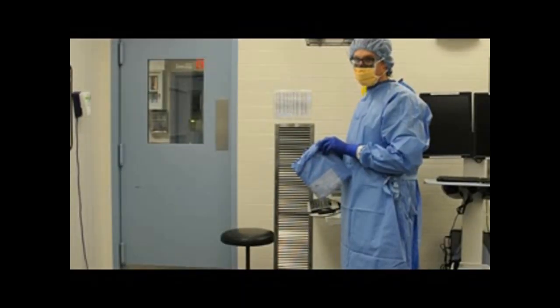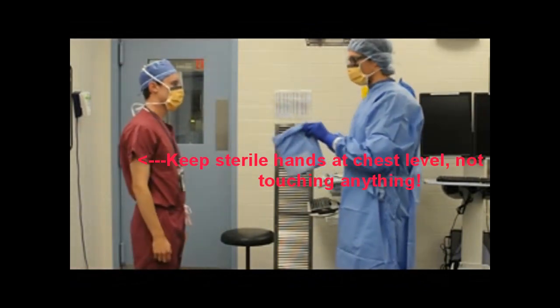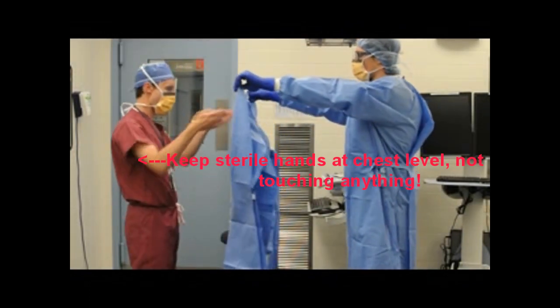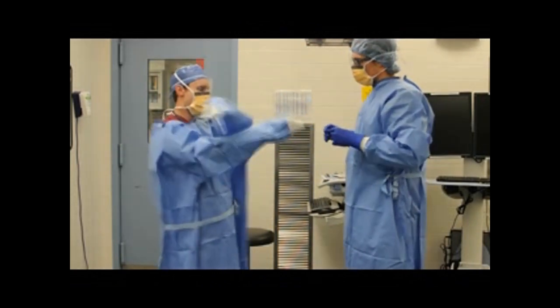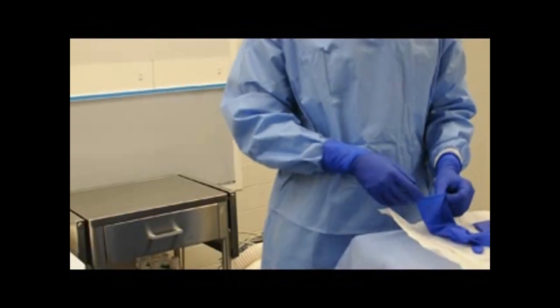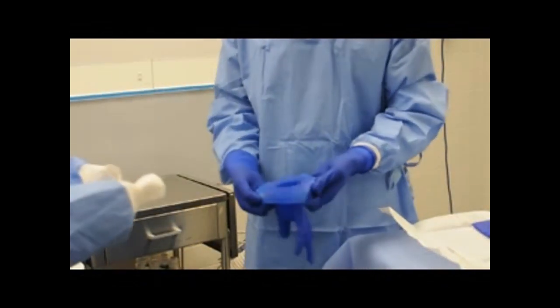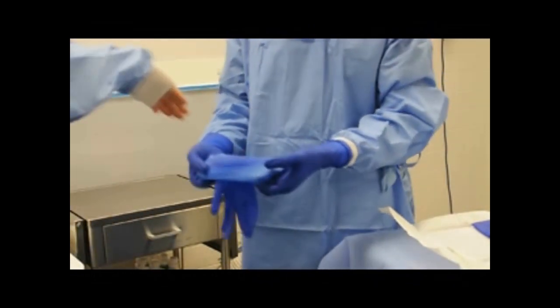After you've scrubbed or Avagarded, you're ready to gown up. Keep your sterile hands at chest level — unlike this idiot. The tech will open up your gown, allowing you to stick your arms in. Keep your hands inside the gown, mostly at the level of the blue fabric. A non-sterile person will close up your gown in the back. Your scrub tech will now stretch open one of your undergloves, at which point you can slide your sleeve up on one arm so your hand pokes out past the white cuff.